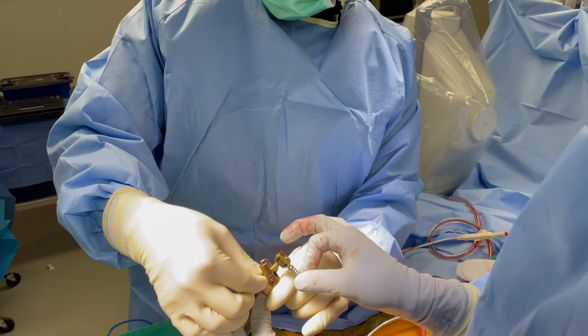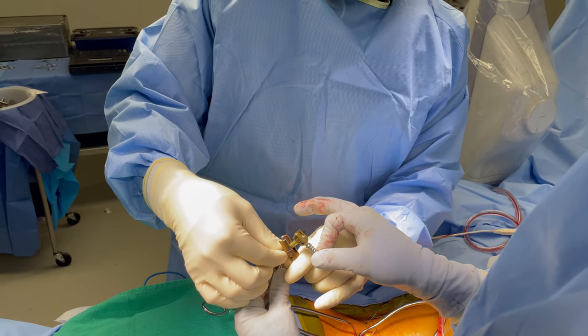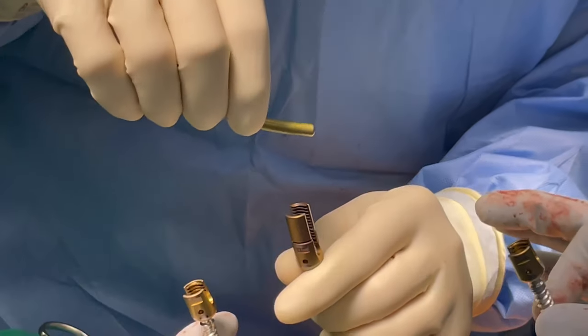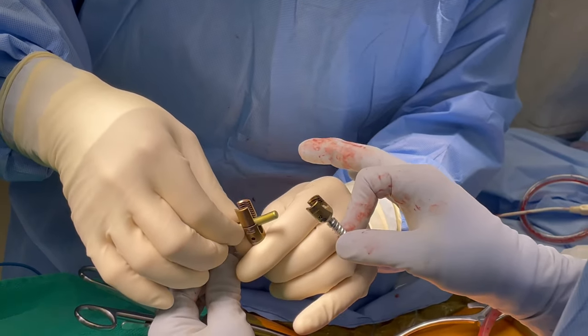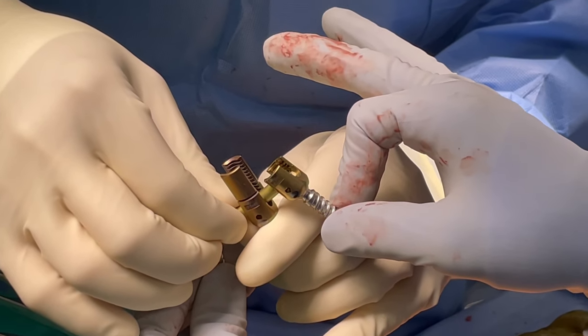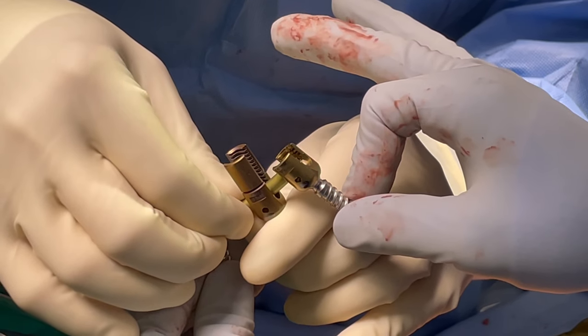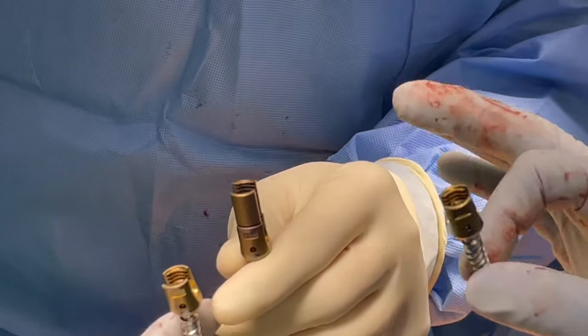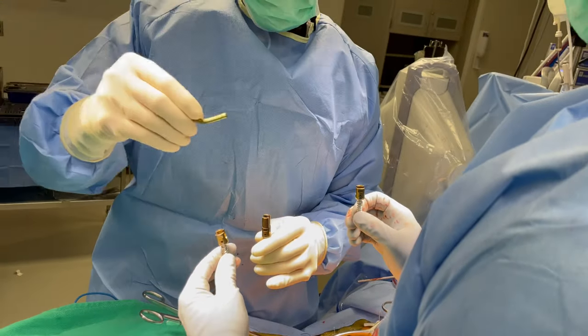These screws are going to be higher than that screw, so you can see there's a gap — this rod is way up high. But what happens is we put set screws that go in the top, and as I tighten that set screw, it pulls this rod back into the same position as the other screws. So this screw is now at the same height as the other ones, with the exception of the curve in the rod that reestablishes a natural curve in the spine.